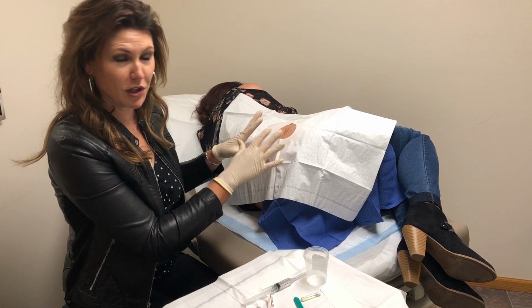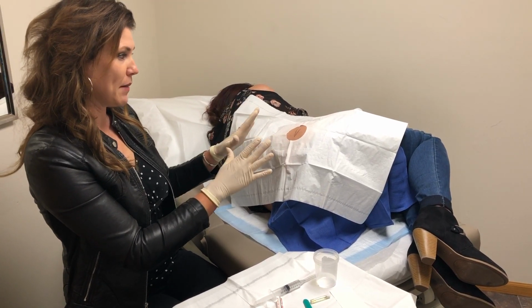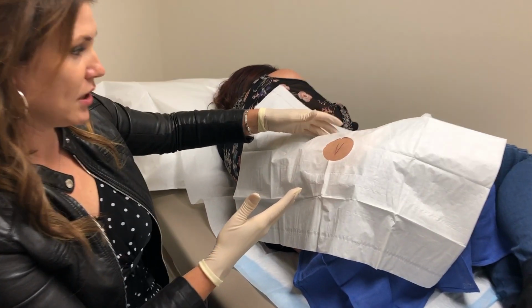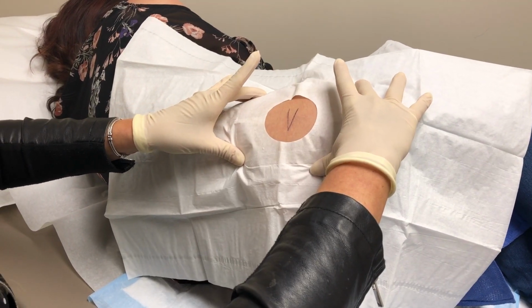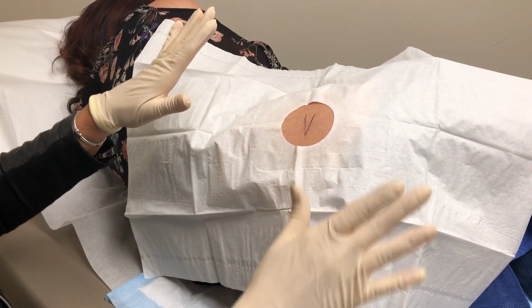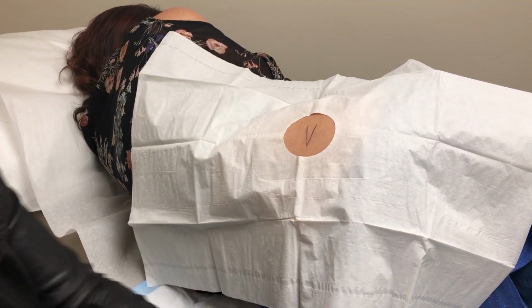the actual procedure itself. So our patient is already draped and prepped, and what we did was we selected a location. This is her upper hip bone right here under my fingers. So this is her upper buttock region. And so we just made a mark here and then cleaned the area with some sterilization solution. And then we have a sterile drape over the top.